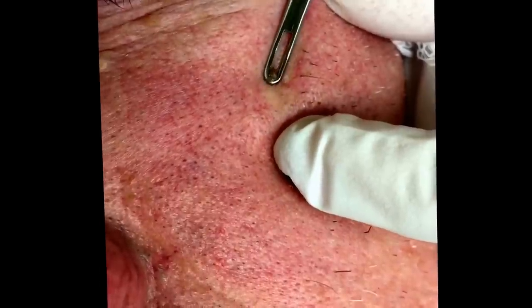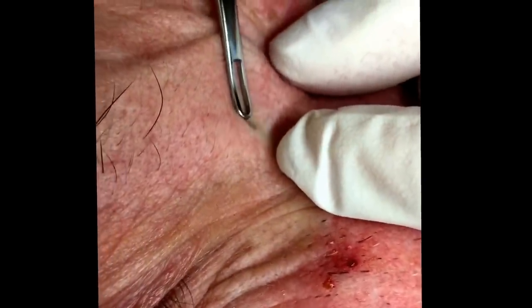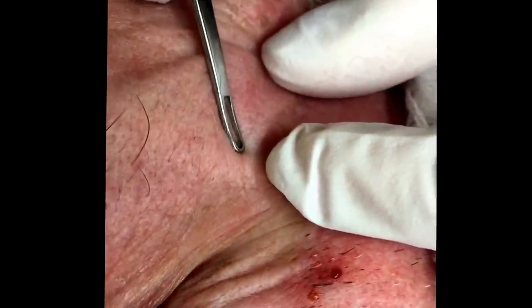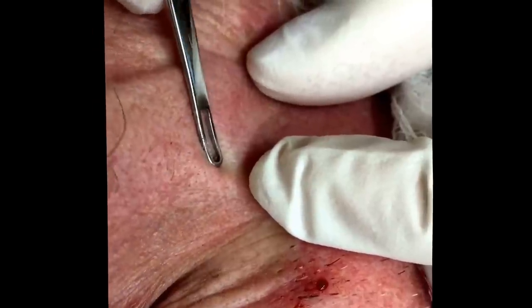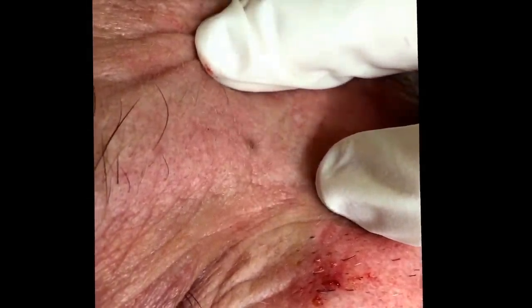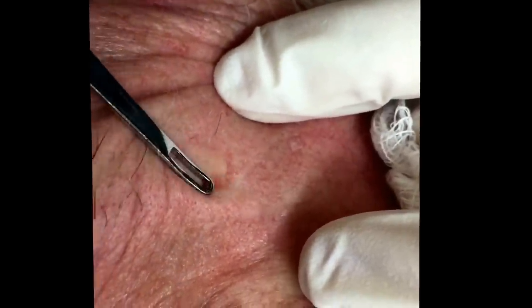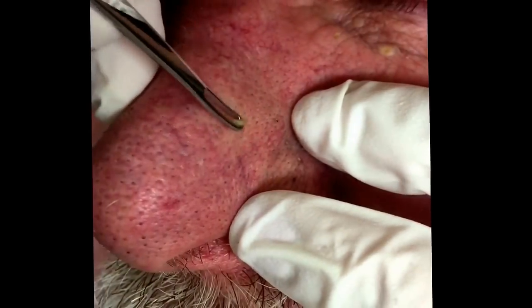Do you remember how I said his hand was more sun damaged? Skin kind of gets trapped under there and it gets oxidized, so it turns dark. You could kind of say it's dirt, but it's not anything part of our body that we need anymore. Sorry — that one's a little pinchy. I'm going to pinch you one more time. I have to break and expose it so I can take it out. There we go.